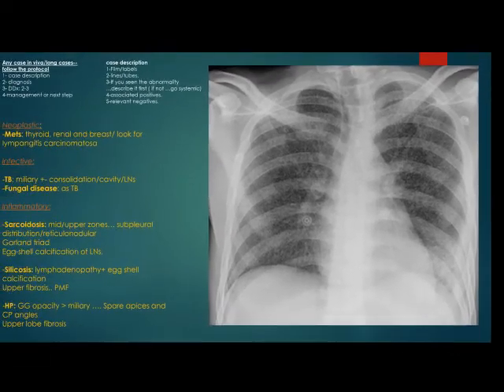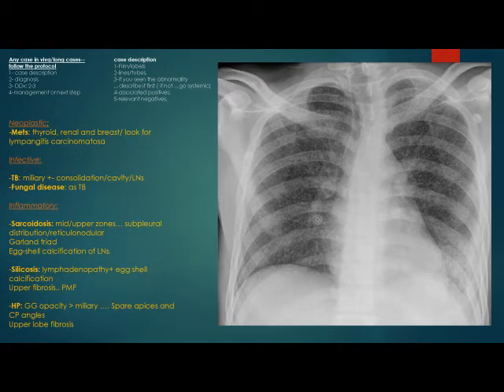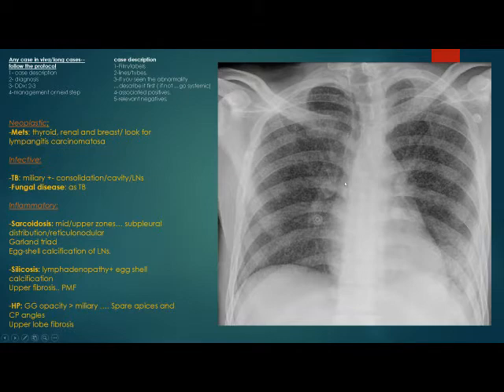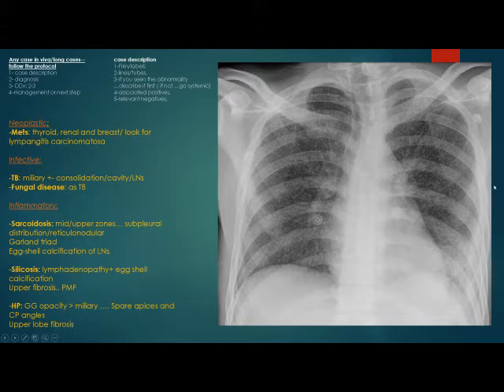Now let us return to the film. Hilar sizes are normal bilaterally. There is no paratracheal thickening and no evidence of lymphadenopathy. Cardiac size is slightly prominent. In the periphery of the image, there is no obvious soft tissue thickening or abnormal shadowing, and we cannot identify any bone pathology.